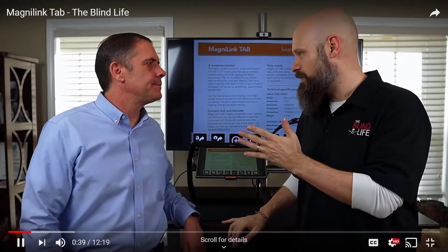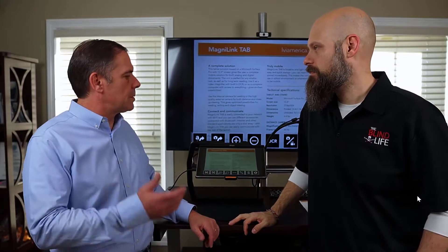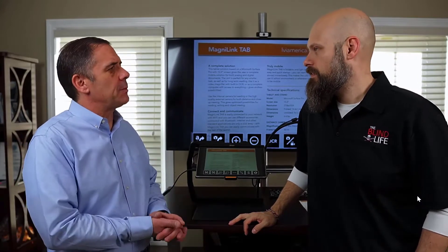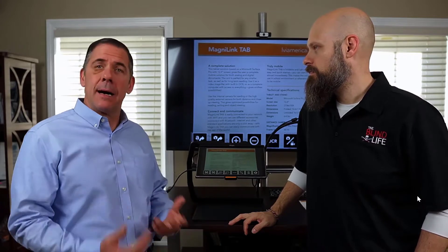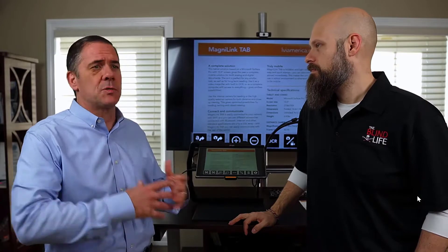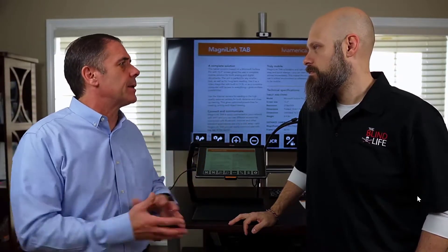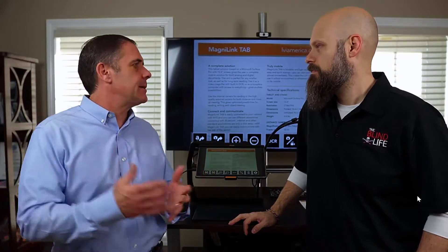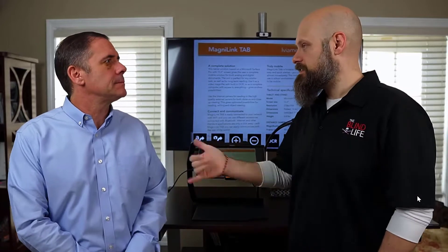Ideally, who would this device be best suited for? Well, students, because it's so transportable — collapsible, throw it in the bag, moving from class to class. That could be high school or college. And definitely the professional — someone going in and out of boardrooms, traveling, somebody that maybe doesn't just sit at a workstation, moves around a little bit, and wants magnification and speech wherever they go.